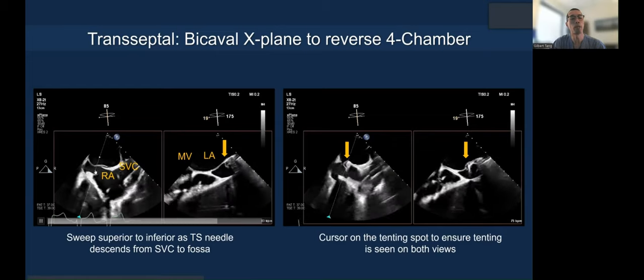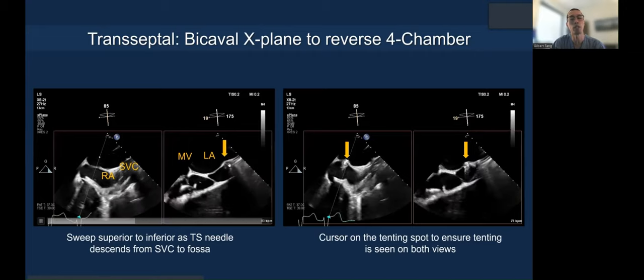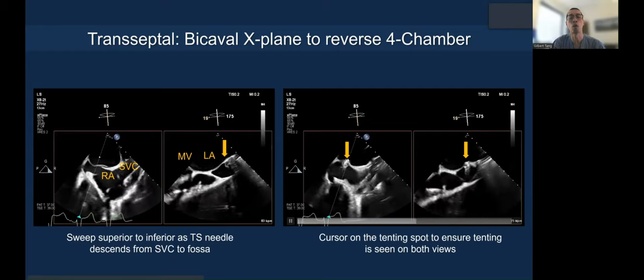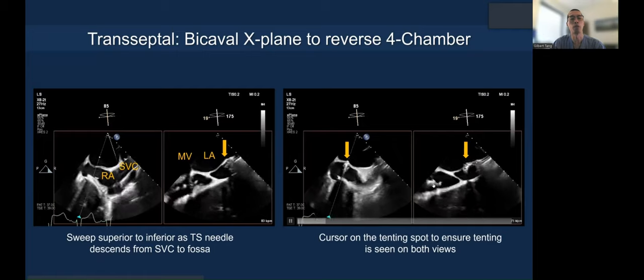You sweep superiorly down to the fossa to track your transeptal needle. Here this is the SafeCross system with a balloon tip, and the cursor is on the tenting spot — so you know exactly where it's tenting, how posterior you are. You need to see that in both views.